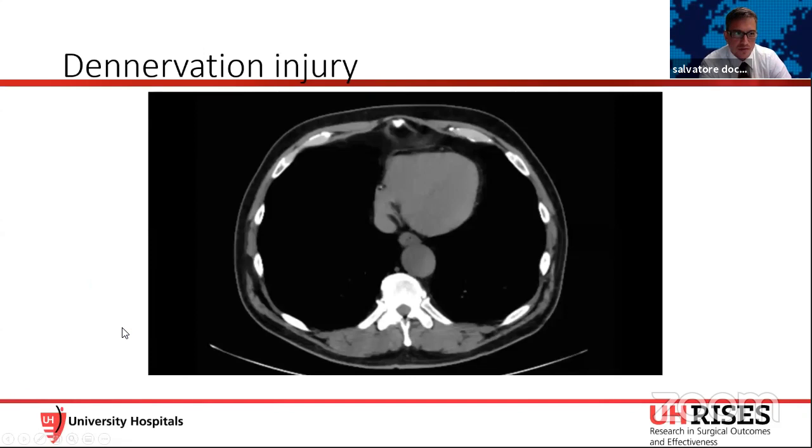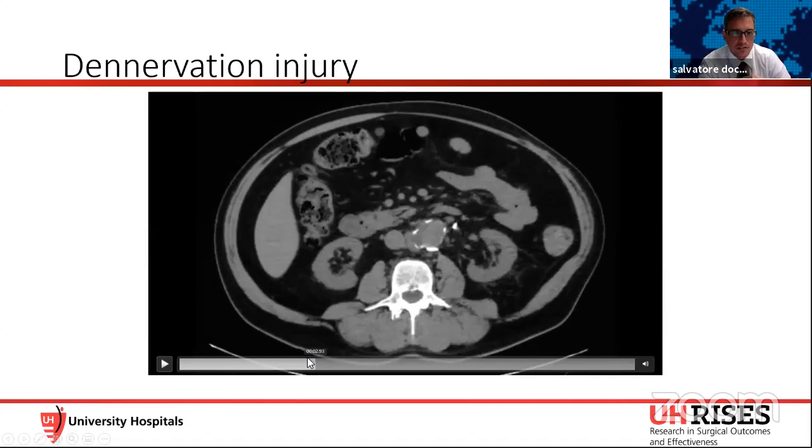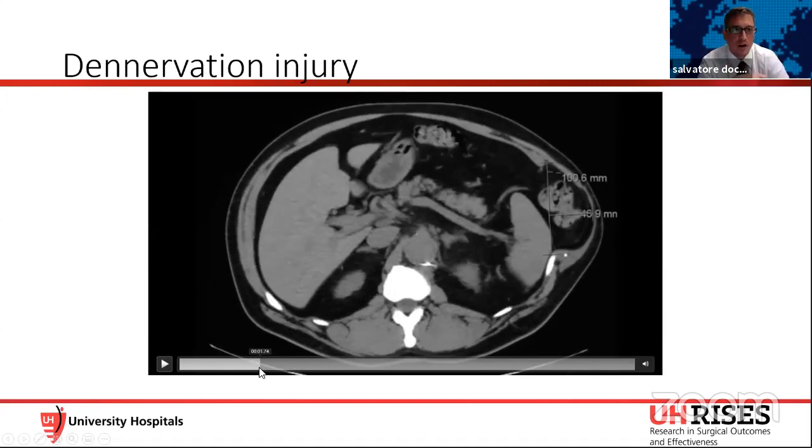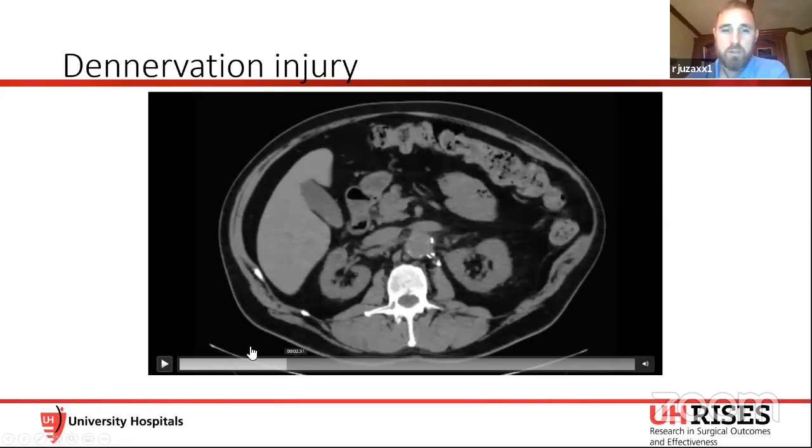Ryan, another thing too is, does this come with time in terms of understanding the denervation of like the rectus muscles, for instance? Is it just more seeing a lot of normal CAT scans, or are you just inherently comparing the two different sides and seeing if the volume of one is less than the other? Usually it stands out pretty much to the naked eye when you're looking at that.